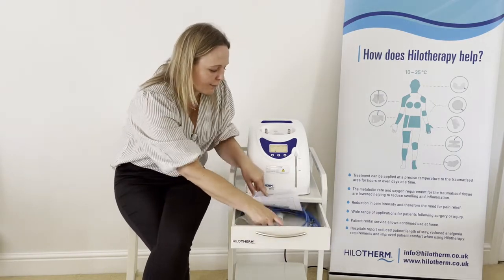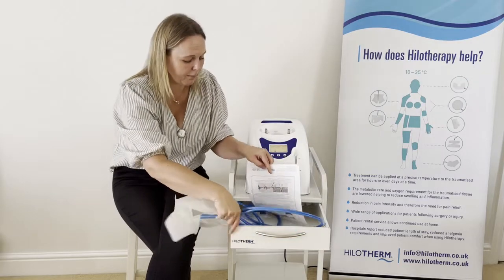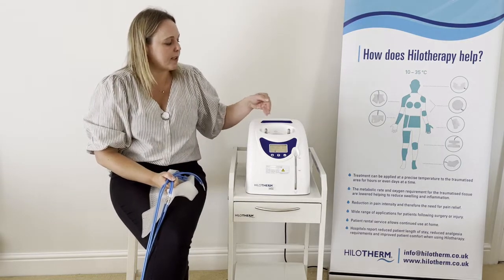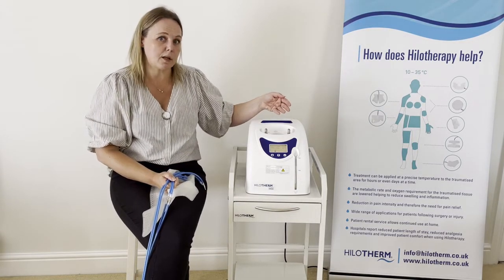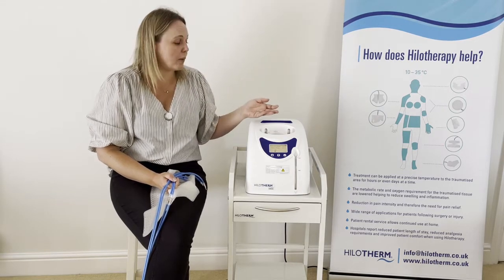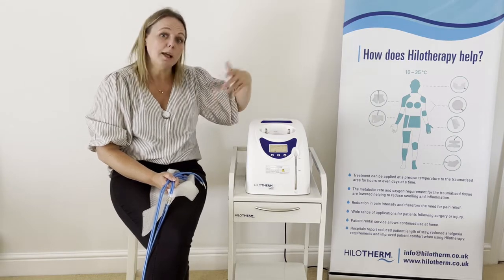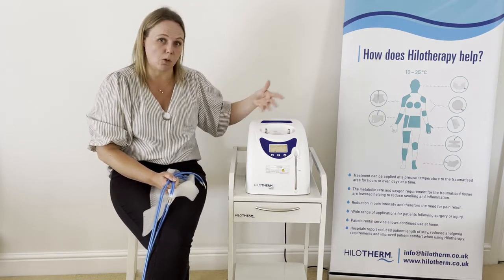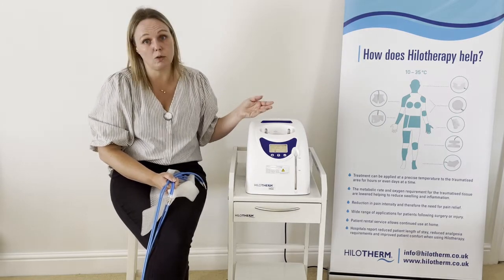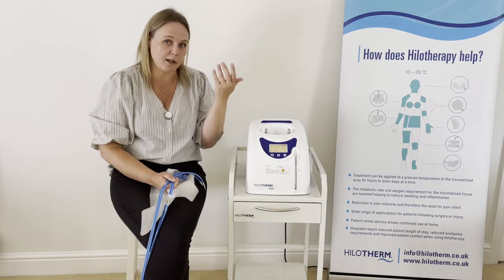I'm going to connect the long blue tubing and the cuff. There are two sets of connectors on the top. The reason there are two is because it is possible to connect two cuffs at the same time. Certainly we have had hospitals use one machine between two patients' beds — two patients on one machine.